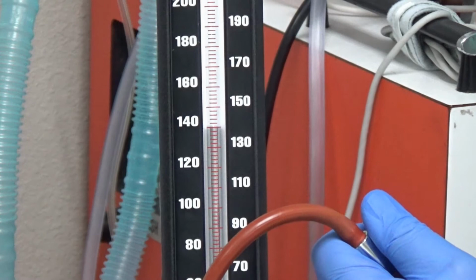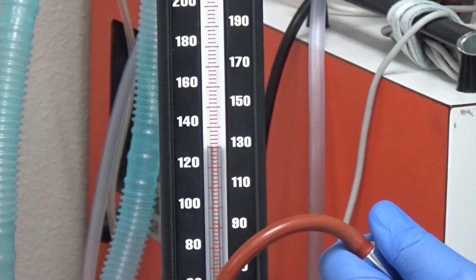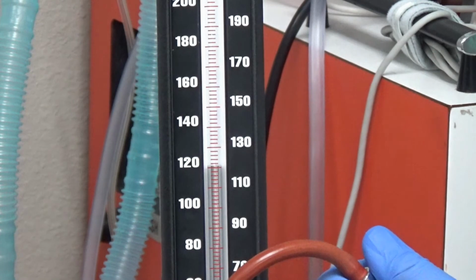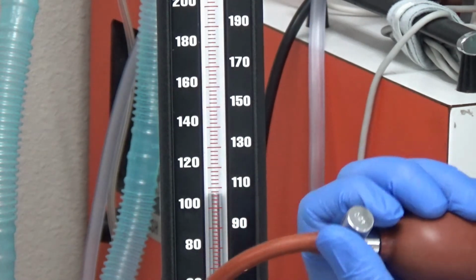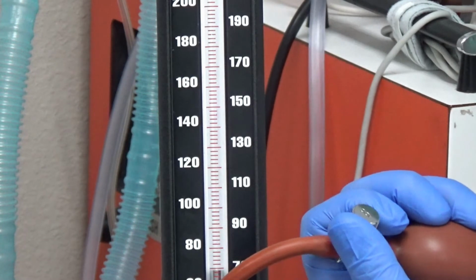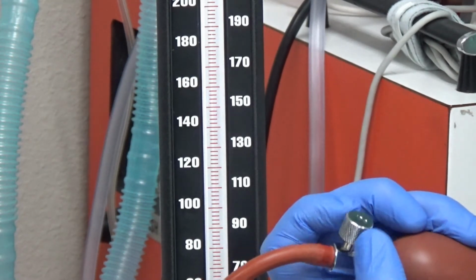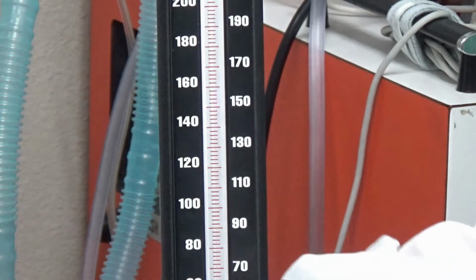You're probably going to start hearing the blood pressure right about here. That'll be your first actual beat right about there, okay? As you're lowering it, you don't hear a beat at first. Your first beat is your systolic. As I continue to go counterclockwise on the balloon, I lower it and lower it. Now my diastolic is going to be the last beat that I hear. Then I'll completely release it, and now we have our systolic and diastolic blood pressure.